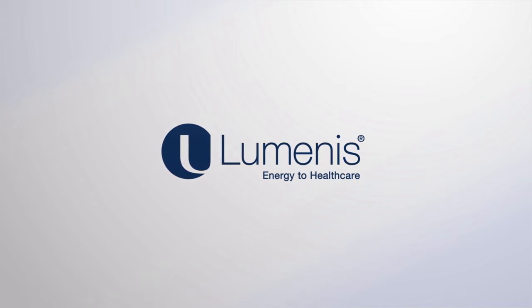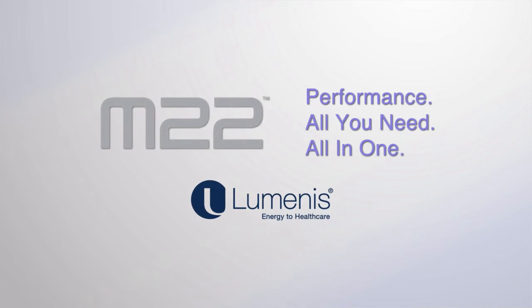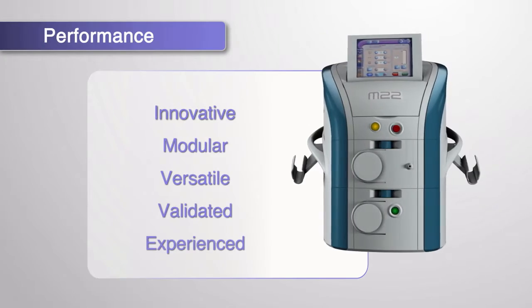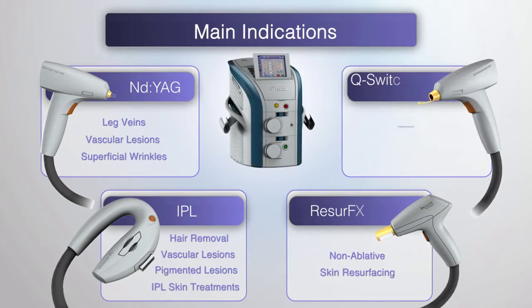In the world of multi-application platforms, performance is everything. Performance is the distinct difference of M22. M22 is a multi-application platform and has four world-class technology modules. All you need, all in one.